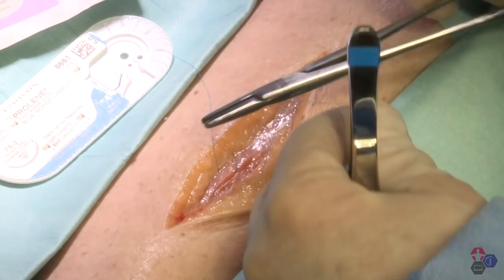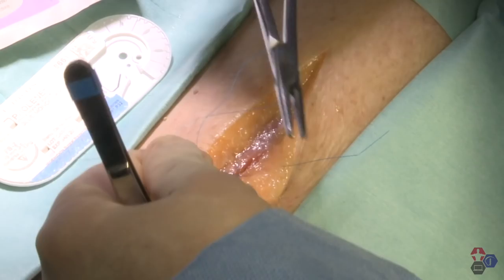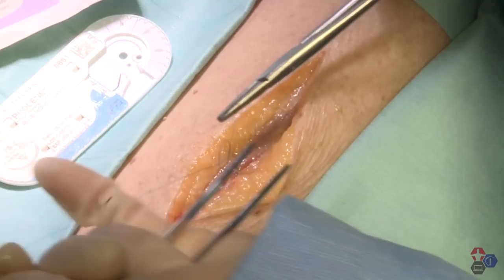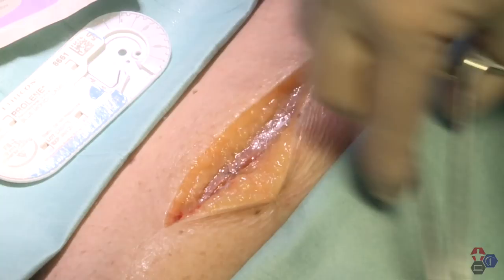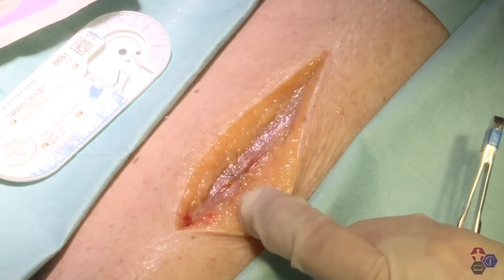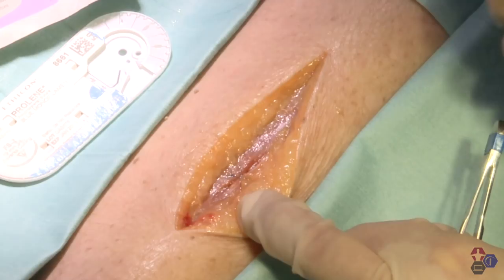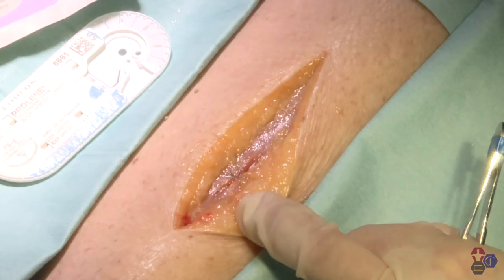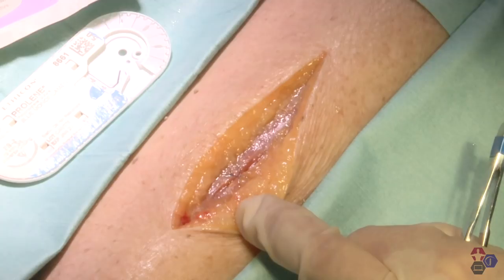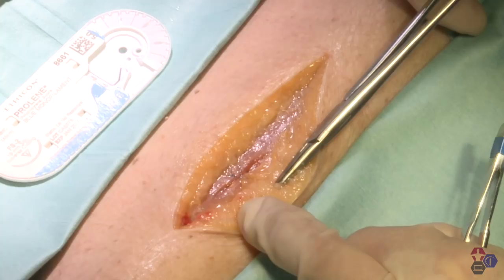We're going to do a surgeon's knot, lay that down, put our locking stitch in, and three throws, then cut that down close to the knot. You can see that this figure of eight made with Prolene has closed that space — that fascial rent — which will prevent herniation of muscle tissue through that fascia. Depending on how large the rent is, you can place additional figure-of-eight sutures, but you want to place as few deep sutures as you need to because these can become a focus of inflammation and/or infection. I would use an absorbable suture in real practice, but for this demonstration I've used Prolene.